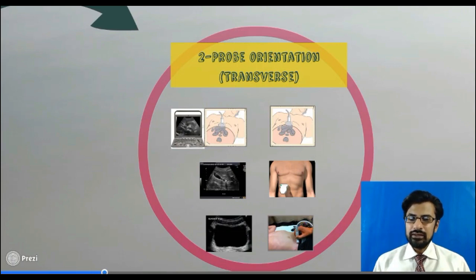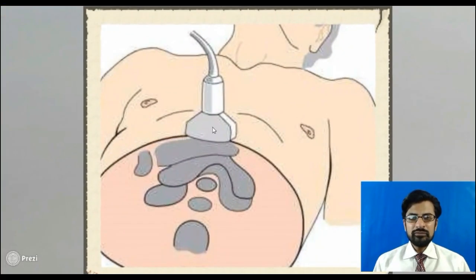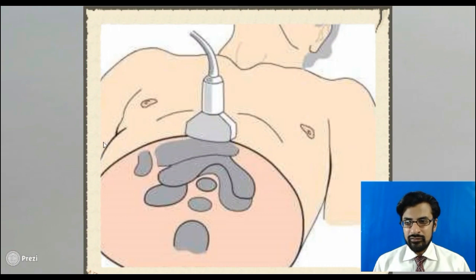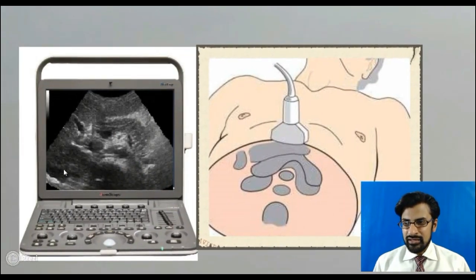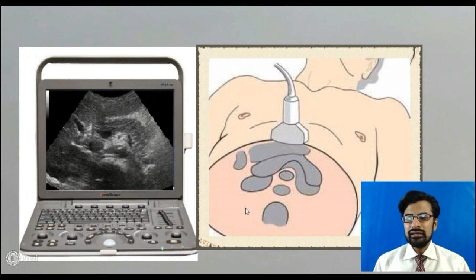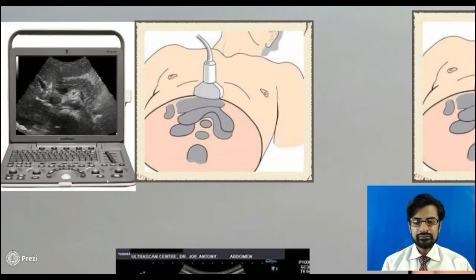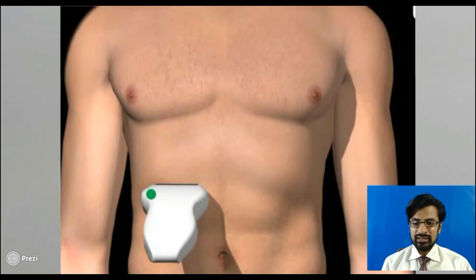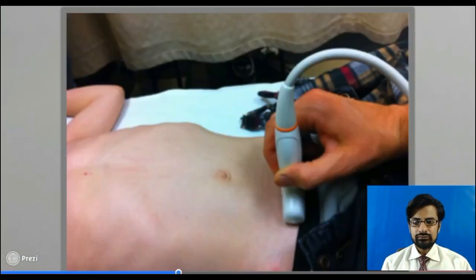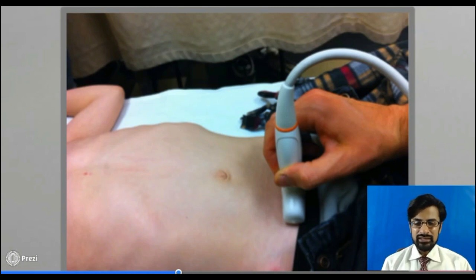The second step is to learn the probe orientation in the transverse plane. It means when the probe is placed with one end towards the right side of the patient and the other end towards the left side of the patient, which structure appears on the right side of the screen, which on the left side, what appears in the upper part of the screen, and what in the lower part. In this image, we have placed the probe transversely in the right hypochondrium. In this image, the probe has been placed transversely in the pelvis.